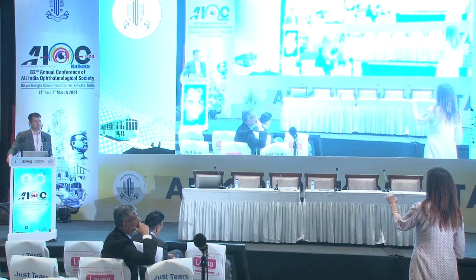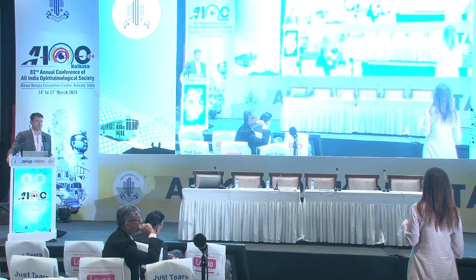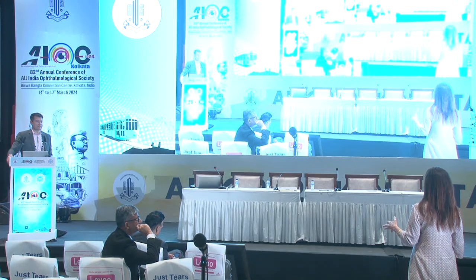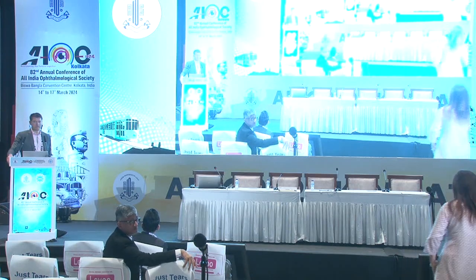The nice thing is that it's a 3-piece lens, so you can also use it in other ways. I've also used it for unhappy patients after a multifocal or EDOF lens. I've done an IOL exchange for the LAL, and you can put it in the sulcus with optic capture, and that works well too. Thank you. Sunil?